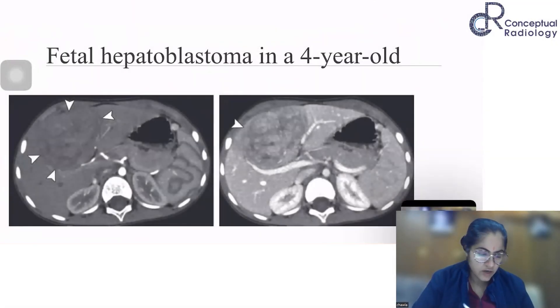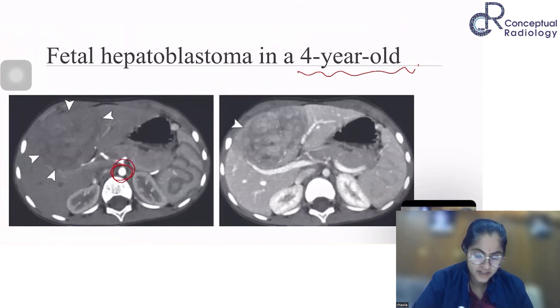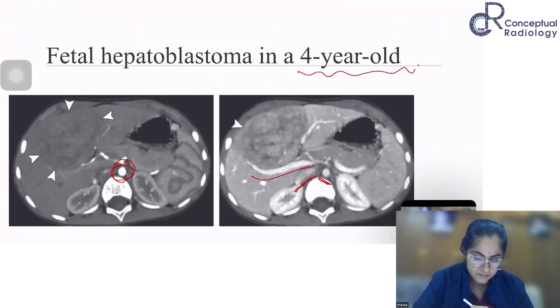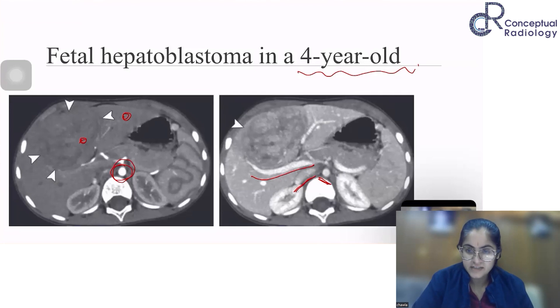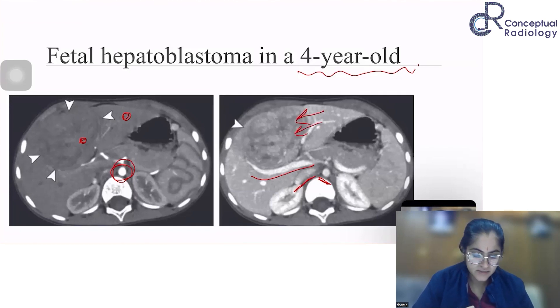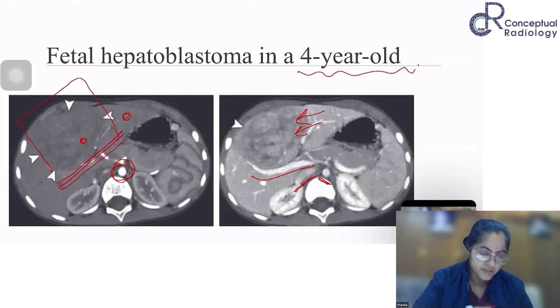Looking at the imaging in a four-year-old child: in the arterial phase we see the aorta enhancing, and in the venous phase we see both the IVC and aorta enhancing along with the portal vein. Compared to normal liver, the lesion is not much enhancing in the arterial phase, and in the venous phase it is hypo-enhancing relative to the adjacent liver. One key finding is arterial phase enhancement within the lesion.